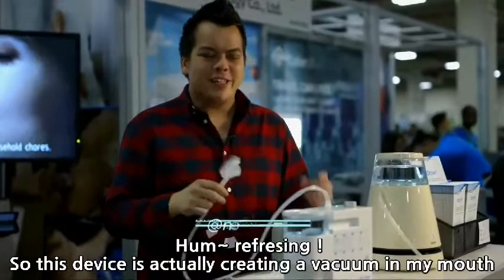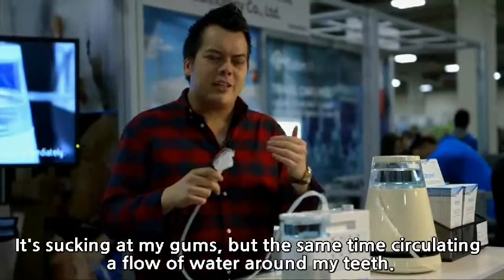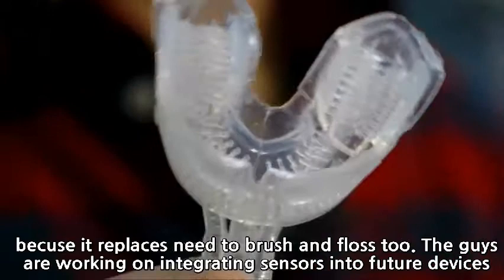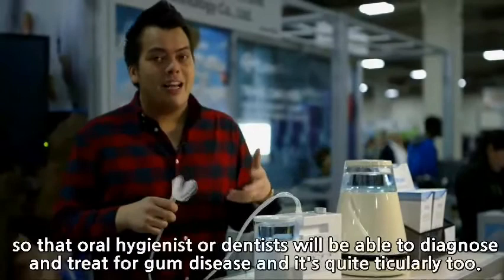This device is actually creating a vacuum in my mouth, sucking at my gums, while at the same time circulating a flow of water around my teeth. It's intended for users with reduced mobility or people who generally have difficulty brushing their teeth, because it replaces the need to brush and floss too. The team is working on integrating sensors into future devices so that oral hygienists or dentists will be able to diagnose and treat gum disease. And it's quite tickly too.